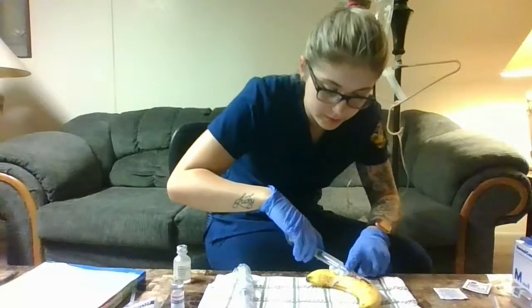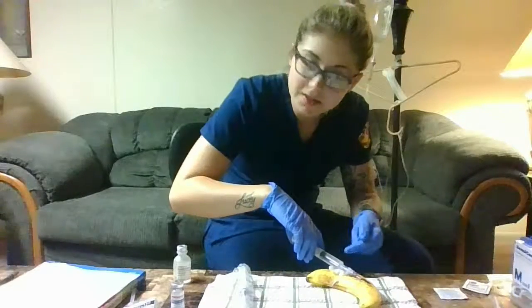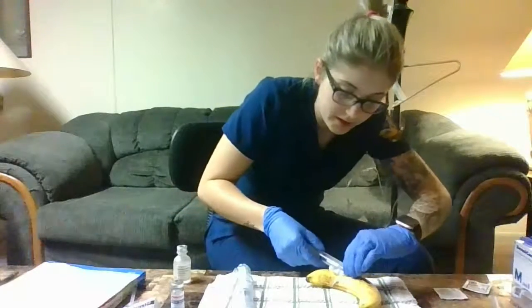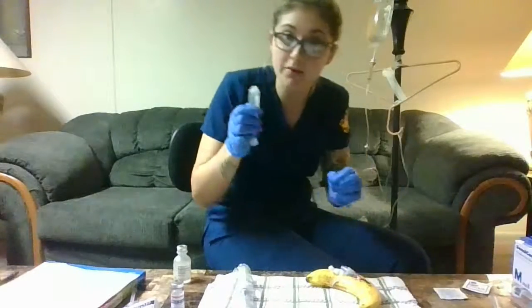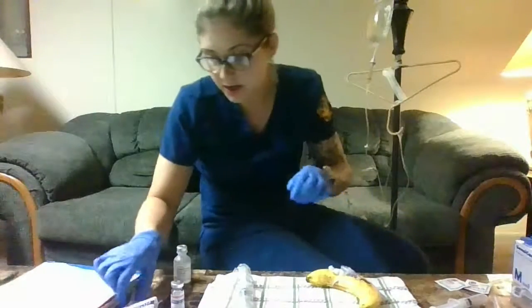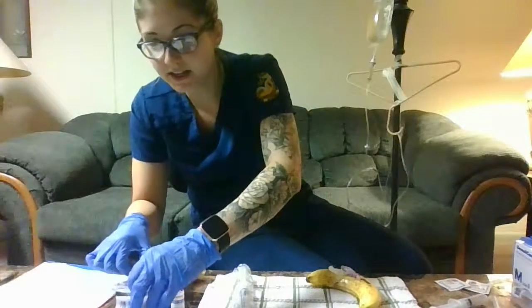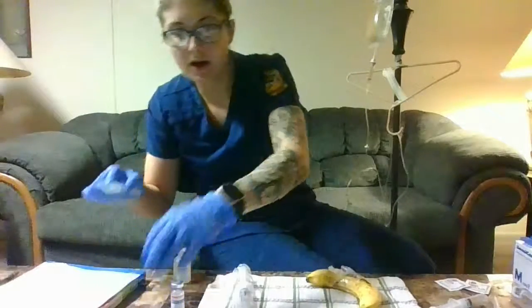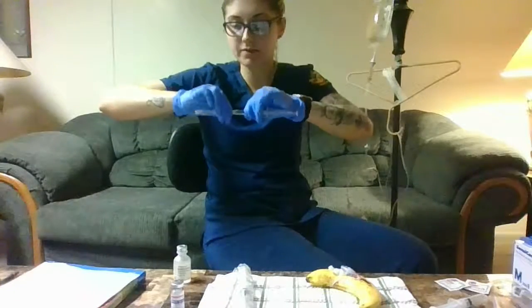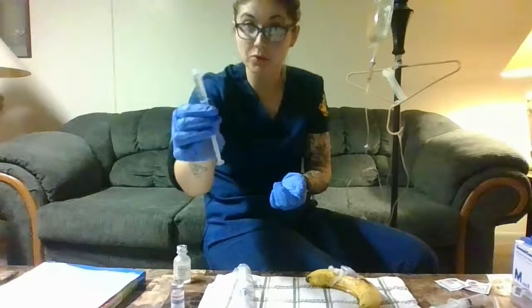twist that in, give the 5 milliliters. While we're doing that, making sure there's no resistance, no pain, and it's going in the vein okay. And then we will take it out once we got 5 milliliters in there. We're going to clean that port again, and then we are ready to give them their medication at their determined rate of administration. So we can take the needle part off here and put it into the sharps container so you don't need the needle anymore.